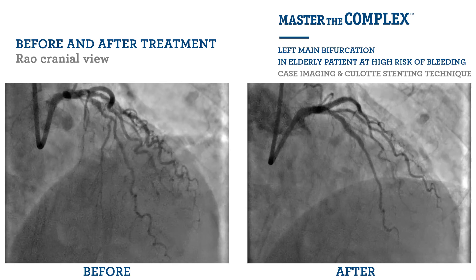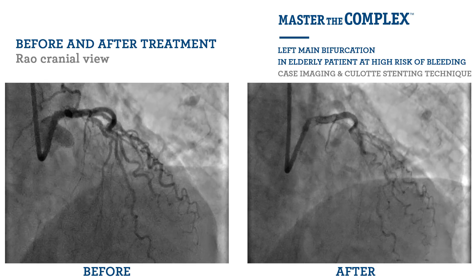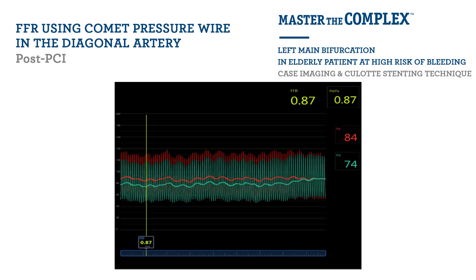There has been some plaque shift into the first diagonal branch. Given the size and importance of this branch, we elected to interrogate the significance of the plaque shift using the comet pressure wire. Using intravenous adenosine to achieve maximal hyperaemia, the FFR was 0.87, which is well above the ischaemic threshold, and therefore this branch did not require any intervention.